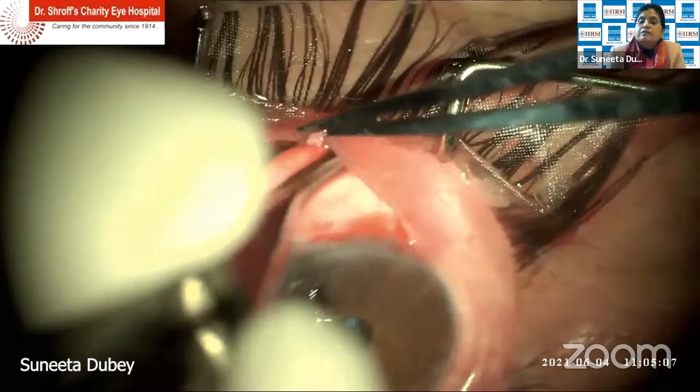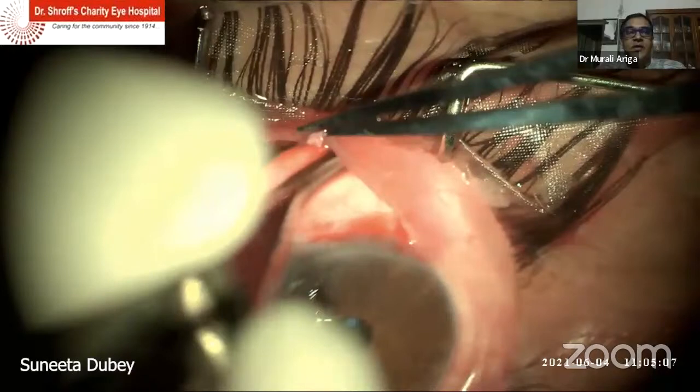There are some drawbacks with Ologen. The primary drawbacks nowadays are availability and cost. The cost has shot up now. Each piece of Ologen, about 6 by 2 mm, the round circular one, costs nearly 7,000 to 8,000 now. Adding 8,000 to the cost of the surgery is not possible for every patient undergoing glaucoma surgery in our kind of setup. So we compared our own data of Ologen with mitomycin, 0.1 to 0.2 mg/ml for 1 to 2 minutes, and found no difference, if not better results with mitomycin.